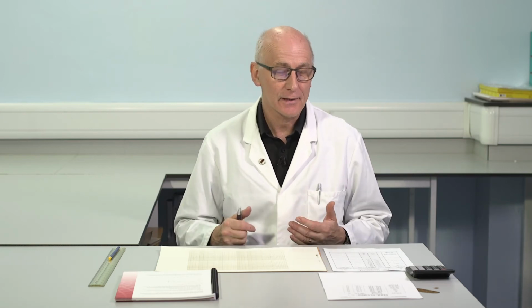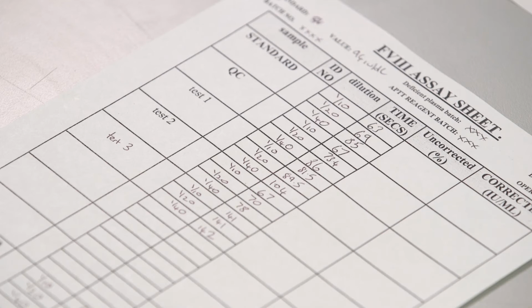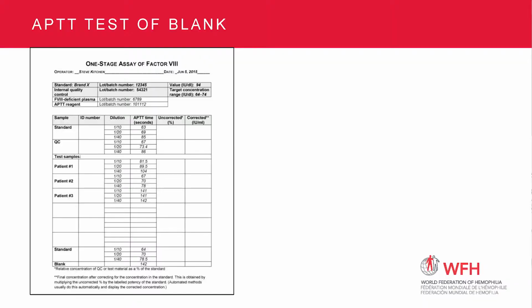So we need to look at the clotting times we obtained. For the 1 in 10 dilution, at the beginning of the assay, 63 seconds. When we repeated the standard at the end of the assay, 1 in 10 dilution, 64 seconds. Not identical, that's typical, but a very similar result, an acceptable variability, the same answer. For the 1 in 20 dilution, beginning of the assay, 69 seconds. End of the assay, 70 seconds. Once again, very similar, acceptable variation.